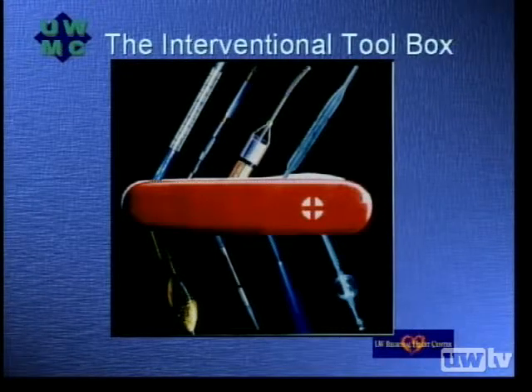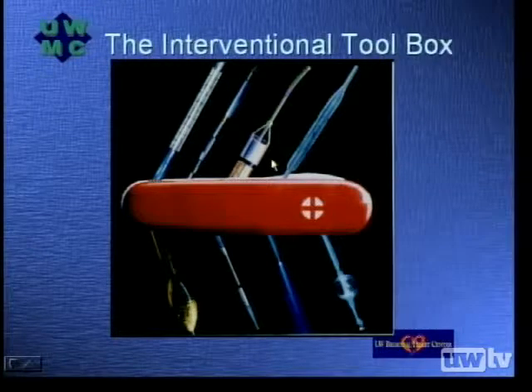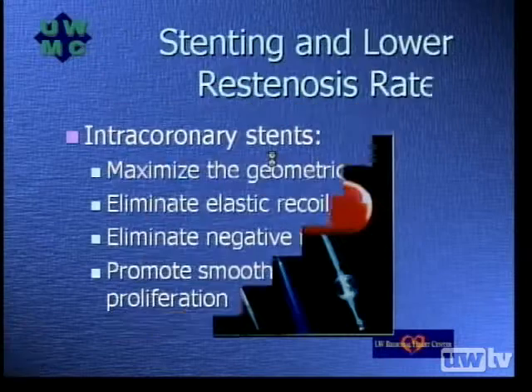And this is sort of a cartoon showing the various approaches that we have had to the problem of restenosis. But I think, as pointed out by Dr. Clues, now that we have been able to solve some of the mechanical problems with the use of coronary stents, for example, we still have the biology to take care of, and that's the reason we continue to see restenosis with our current techniques. But on this slide, again, various techniques, including stents, which are primarily used today, and then also, as I believe was used in this patient, to which Dr. Goldberg will subsequently discuss, cutting balloon.